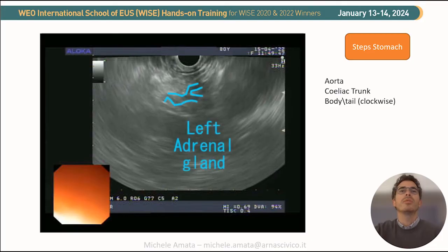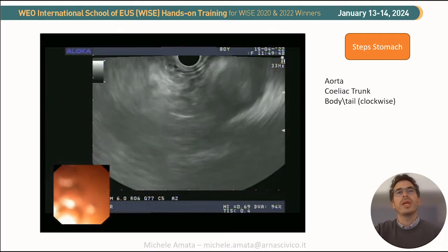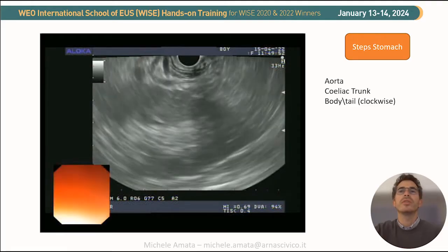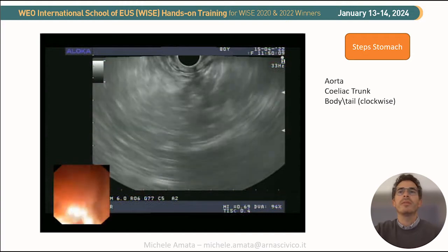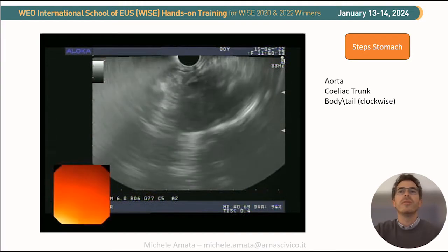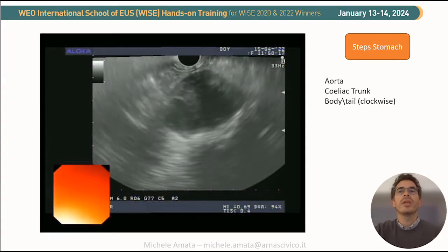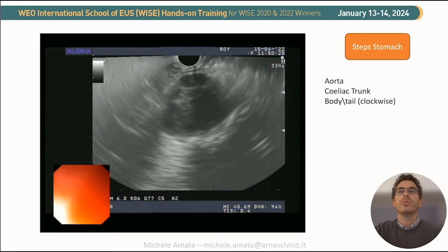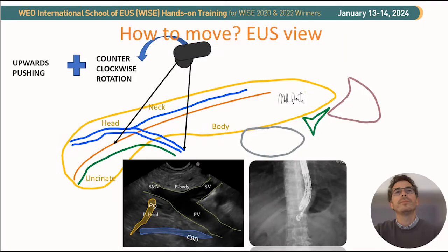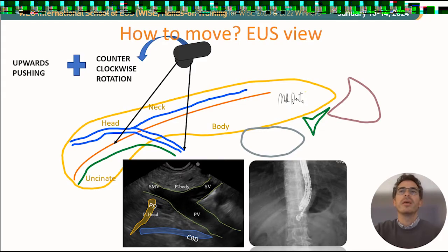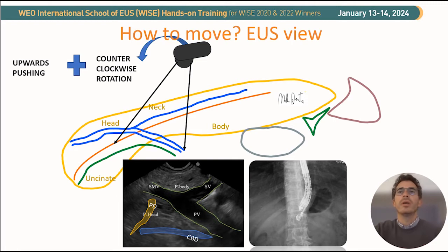We then approach the left adrenal gland with its typical seagull shape. In this clinical case, we are searching for a lesion in the para-aortic space between the aorta and the spleen. Following the structures, we are able to characterize this hypoechoic round lesion, which on histology was compatible with lymphoma. We then turn back to the initial position by doing a counterclockwise rotation, pushing the scope and using the big wheel upwards, following the splenic vein into the portal confluence. The portal vein is now visible, and with careful rotation of the endoscope we can observe the body, neck, and head of the pancreas.